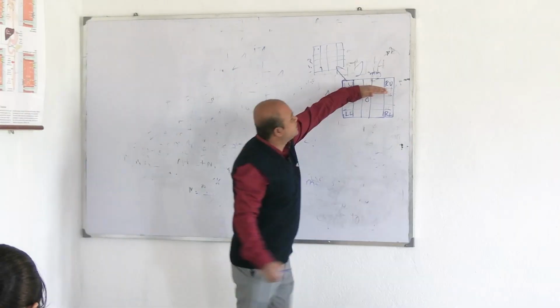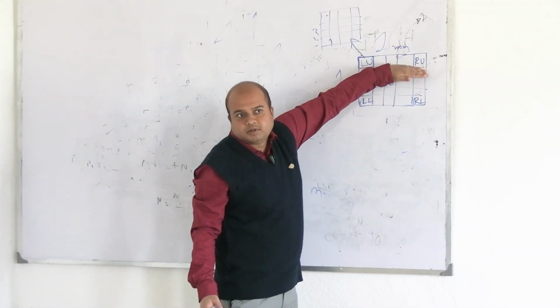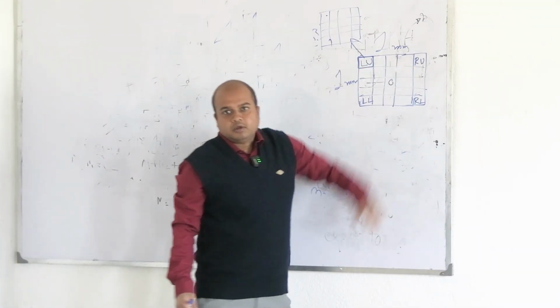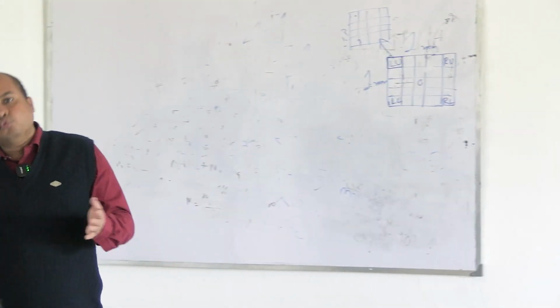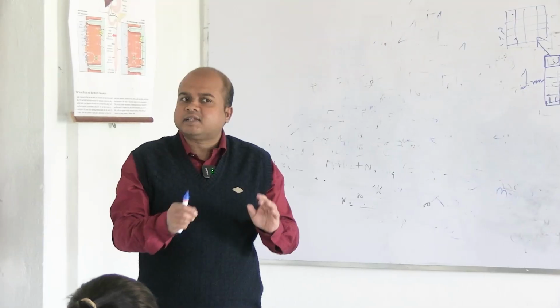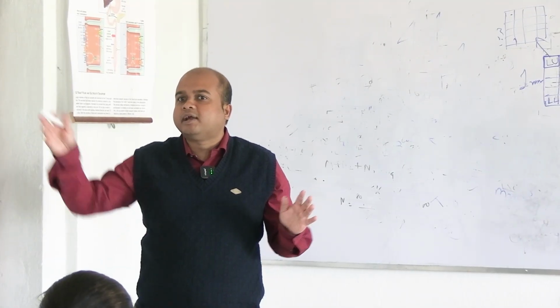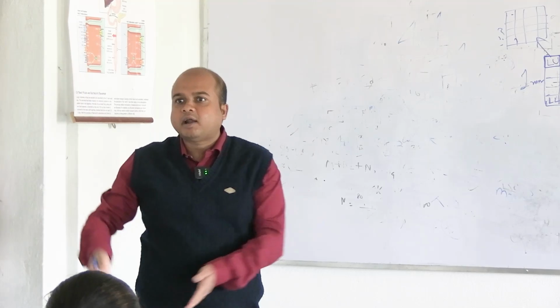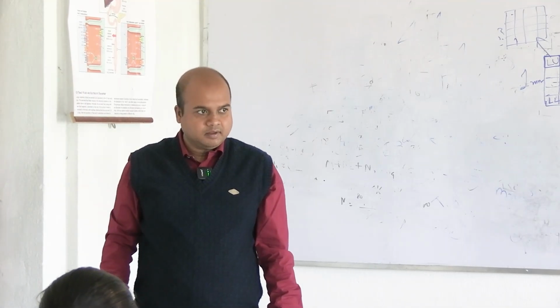If it is not uniform, say cells are restricted to this area, that means I have not done the charging uniformly. So the charging should be uniform so that my accuracy is better, and just to corroborate that, I am assuming this is uniform. It should not be that in the left upper corner square I get 300 cells, but in the right lower corner square there are only 20 cells.